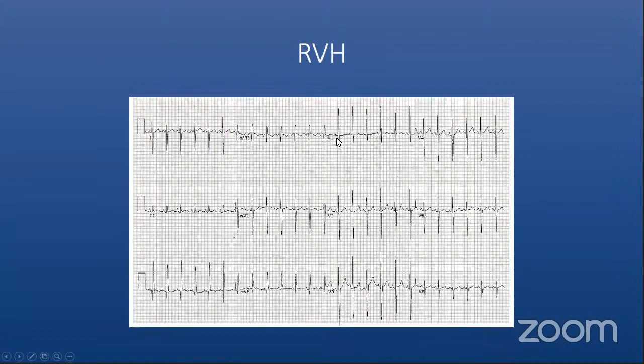Obviously, this is not a neonate, but a little bit older child. And then look at that T wave. T wave, as I said to you, is only positive during the first week of life or after 7 years of age. So T wave upright gives you the indication that this is right ventricular hypertrophy. And then look at the R forces in V1, V2, and the S forces in V5 and V6. So basically, this tells you about the right ventricular hypertrophy.